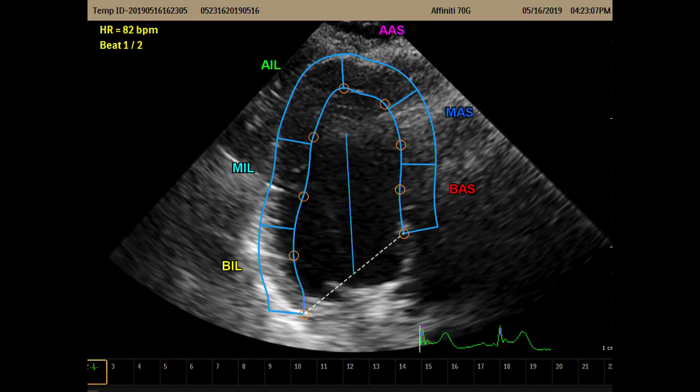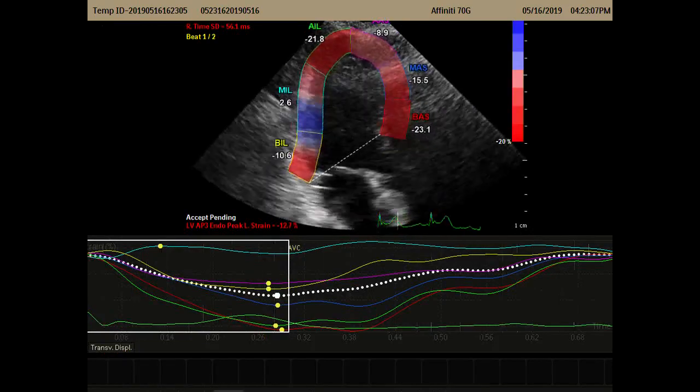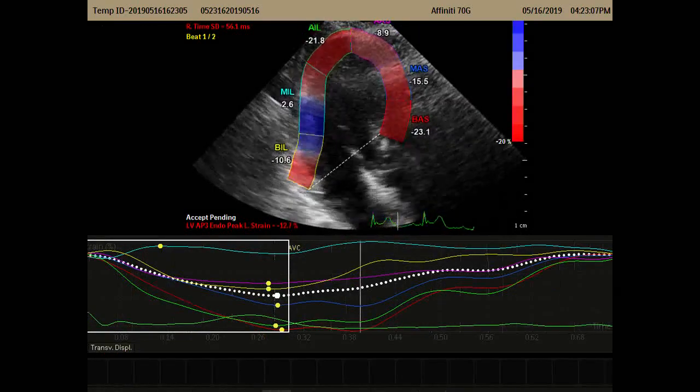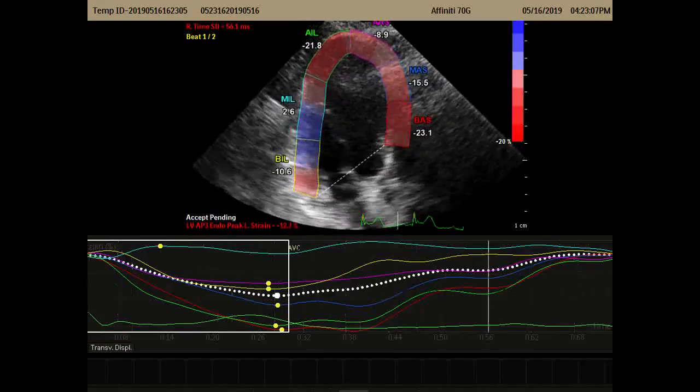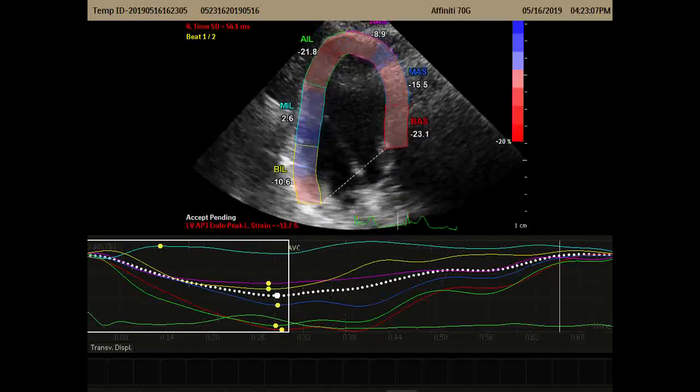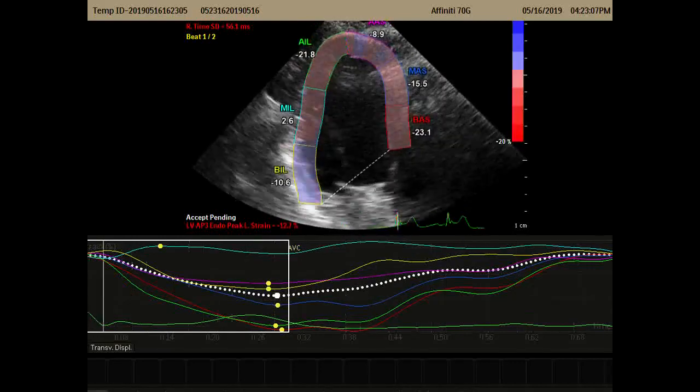You're going to get super frustrated with the machine the first 5 or 6 times you play with it, because there's a lot of little idiosyncratic features that you'll just run into that you just never thought were relevant before, like the heart rate variability, PVCs, a little bit dropping out from the lateral wall sector width. All of these little issues that, like in the grand world of point-of-care ultrasound, don't really matter. They matter a lot when it comes to something that's semi-automated, where you have to kind of set everything up, and then the program can run its thing.